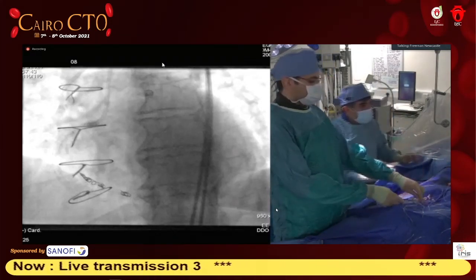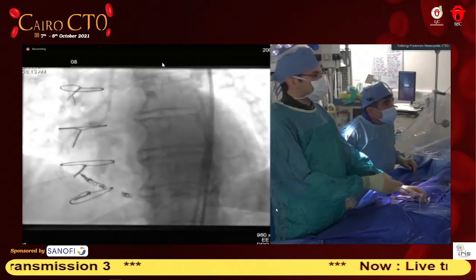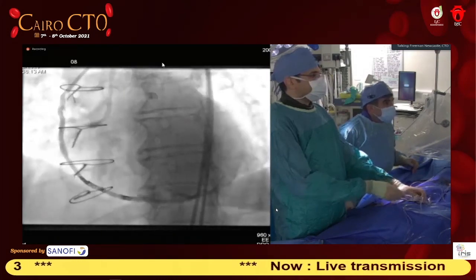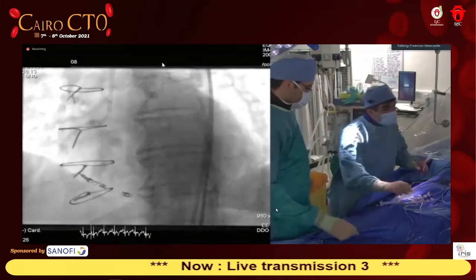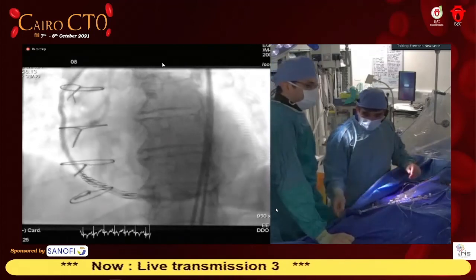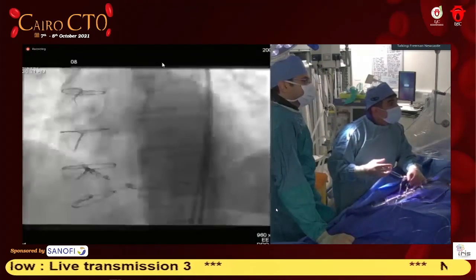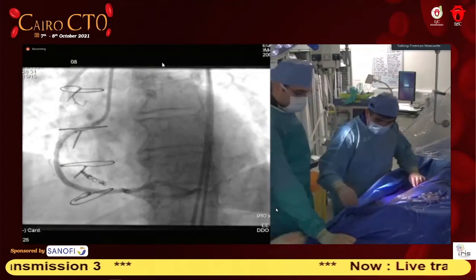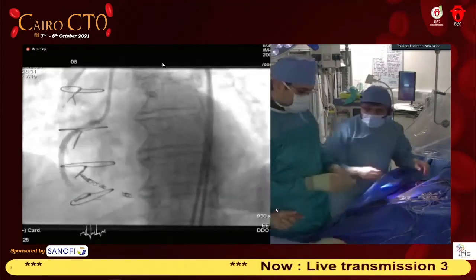We'll take a little test here. It's not going to block off immediately. I think you don't want to block now. You can wait for some time, because it will definitely close. I wanted to put a hairy coil, which is really very good in promoting thrombosis quicker, but no need. We'll do an IVUS here and show you the RCA, the IVUS, and we'll be done, because I think we need some more optimization of this.